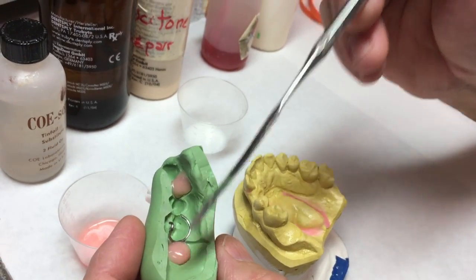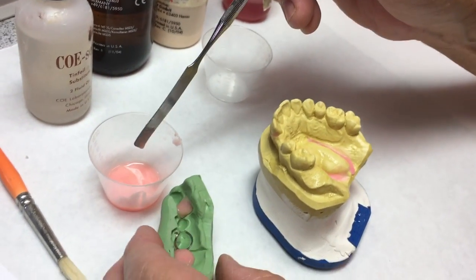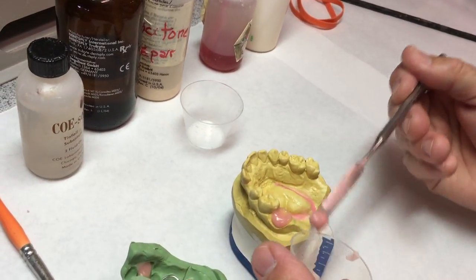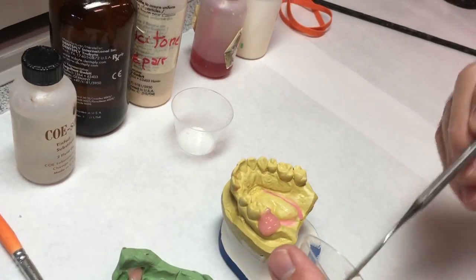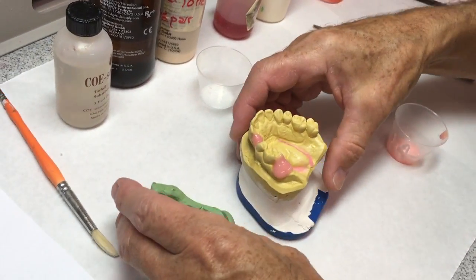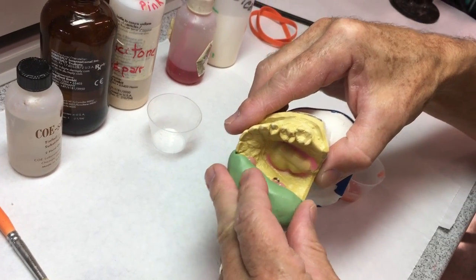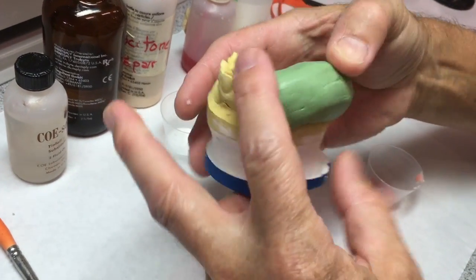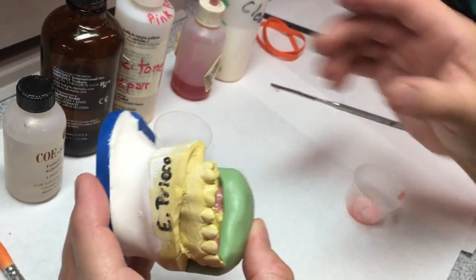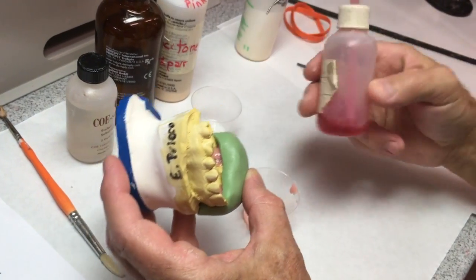I wet the teeth with some monomer so they get a good bond to the acrylic. I'm applying it both to the teeth and to the edentulous ridge. Once I've got that on there, I'm going to put the matrix on to put the teeth back in the right position. I want to be sure that the matrix is seated all the way — and it is. Now I need to hold it in place and start salt and peppering the acrylic in the palette with ortho resin.